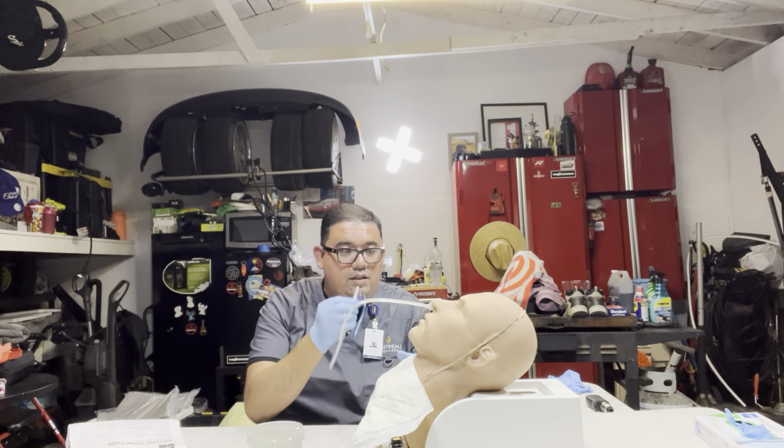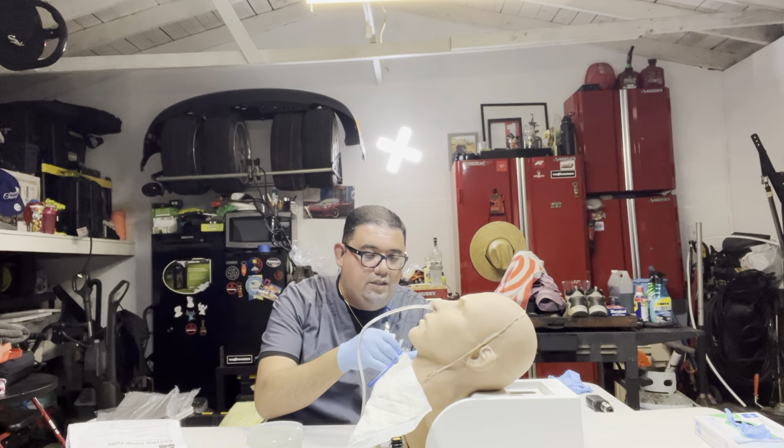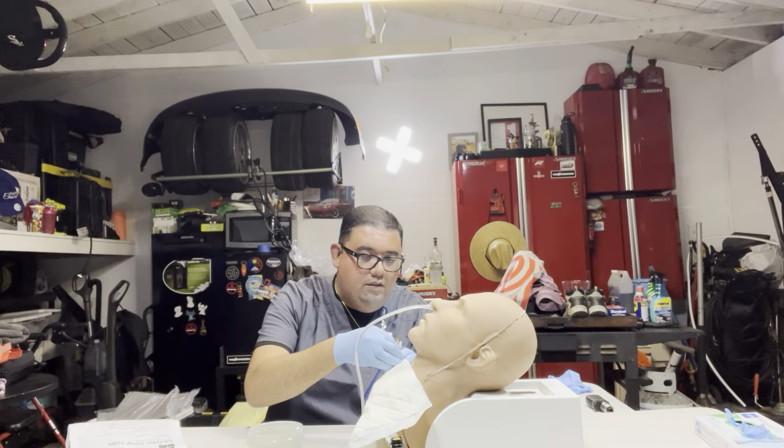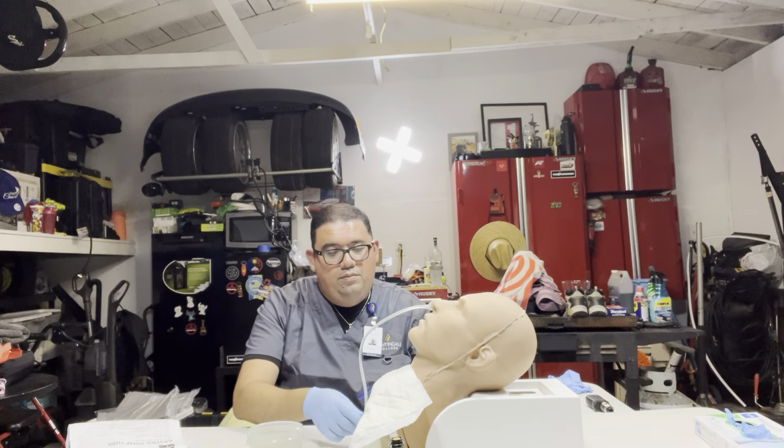Then we'll place it on the patient's gown. So James, pin this tube to your gown, okay, so it stays intact. Perfect.